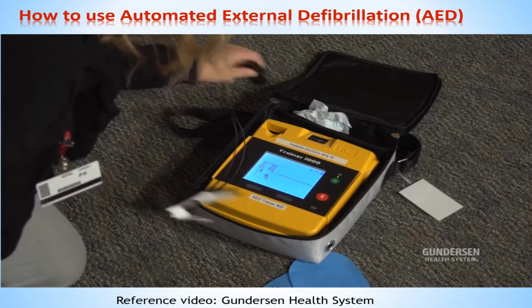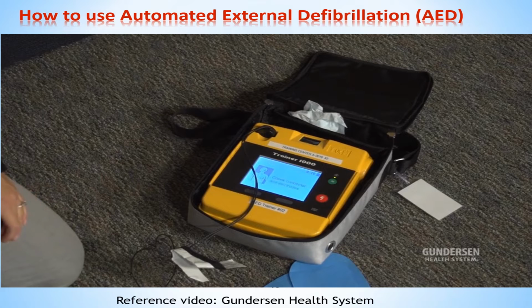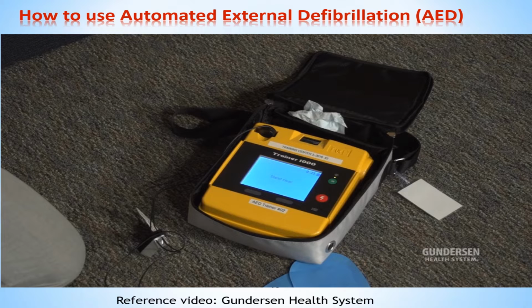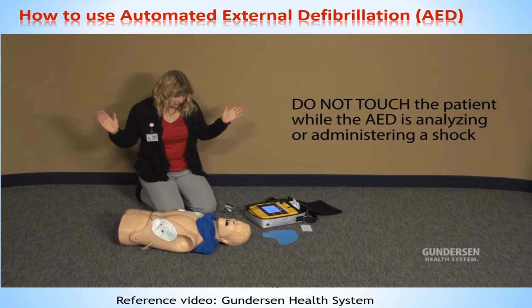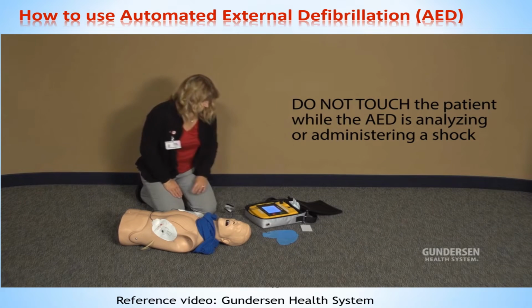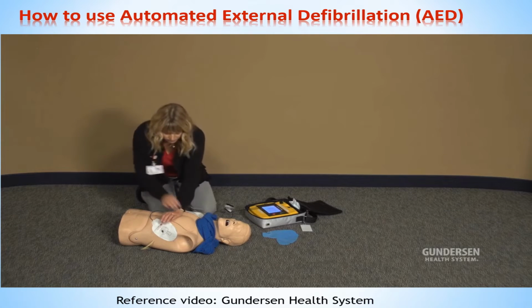If the AED doesn't start analyzing automatically once the pads are applied and cables are connected, plug in the connector. Push the Analyze button and allow the AED to analyze the person's heart rhythm. It is important that nobody touches the patient while the AED is analyzing so it can operate properly. If the AED recommends that you deliver a shock to the person, again, make sure that no one is touching the patient, including yourself. Tell everyone to stand clear and press the shock button. Once the shock is delivered, or if no shock is advised, it is safe to touch the patient.